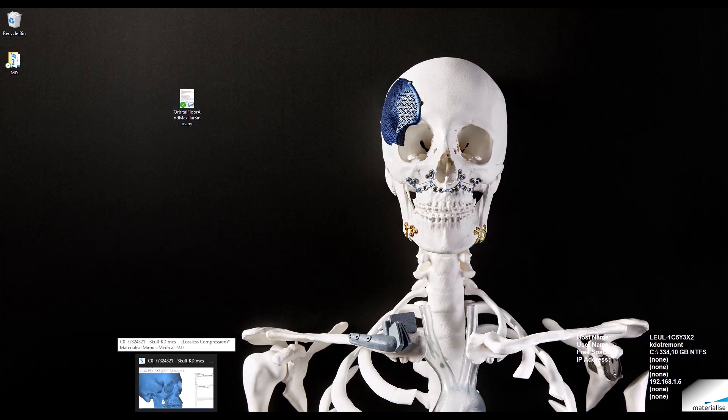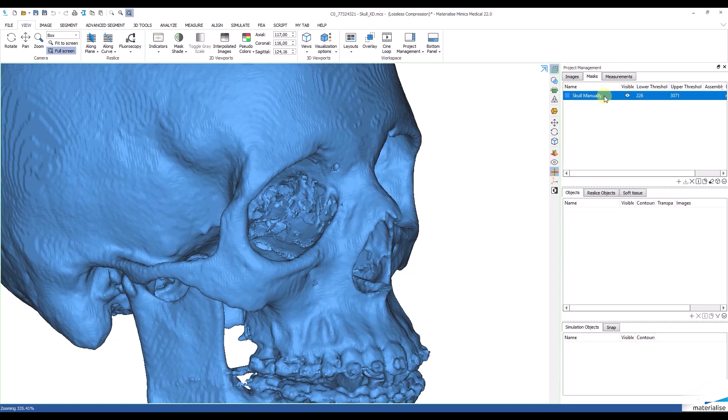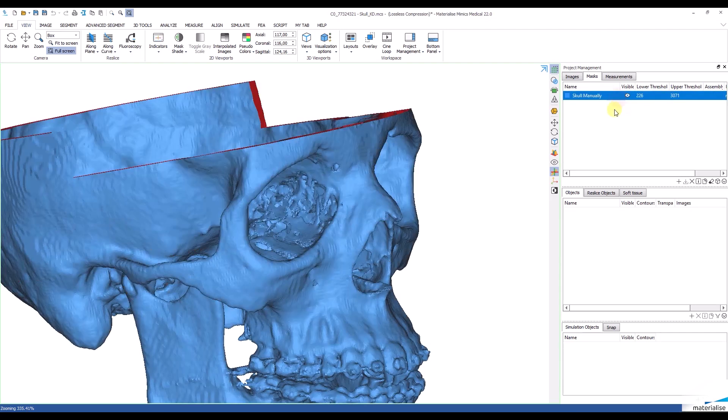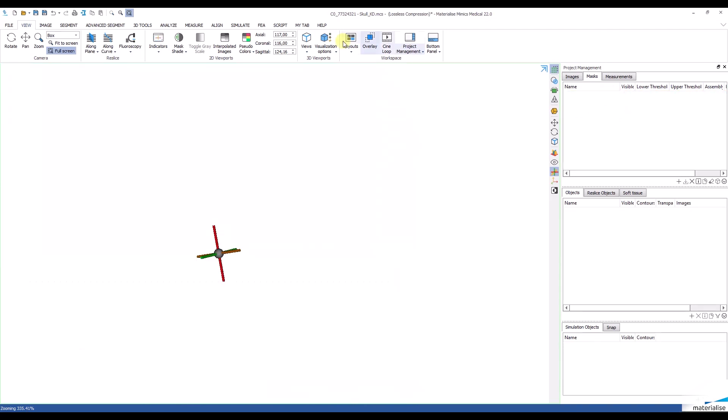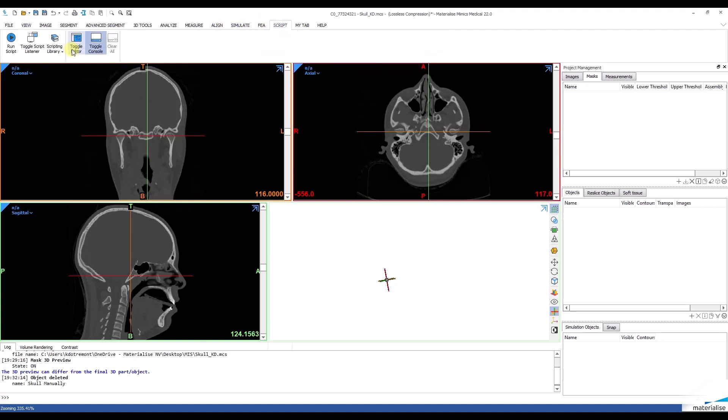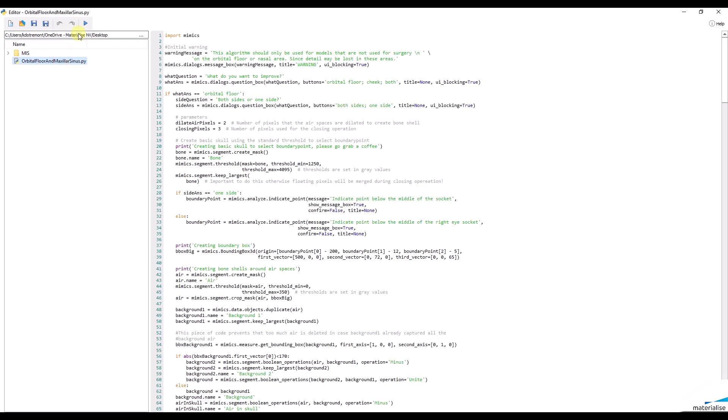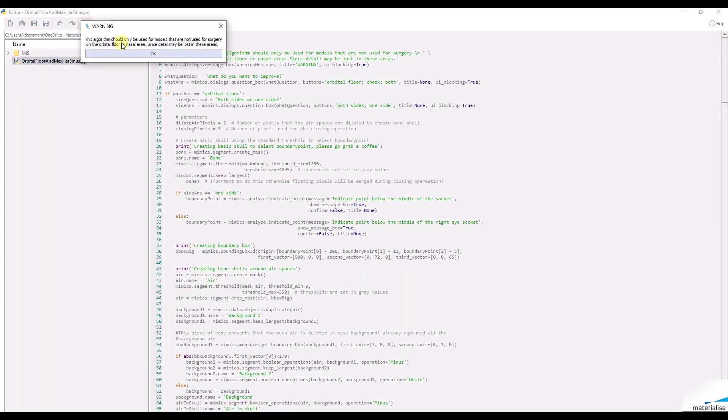Let me go back to Mimix now and create a new project. Hovering my mouse to the scripting tab and opening the editor toolbox. I choose the right file and let it run.